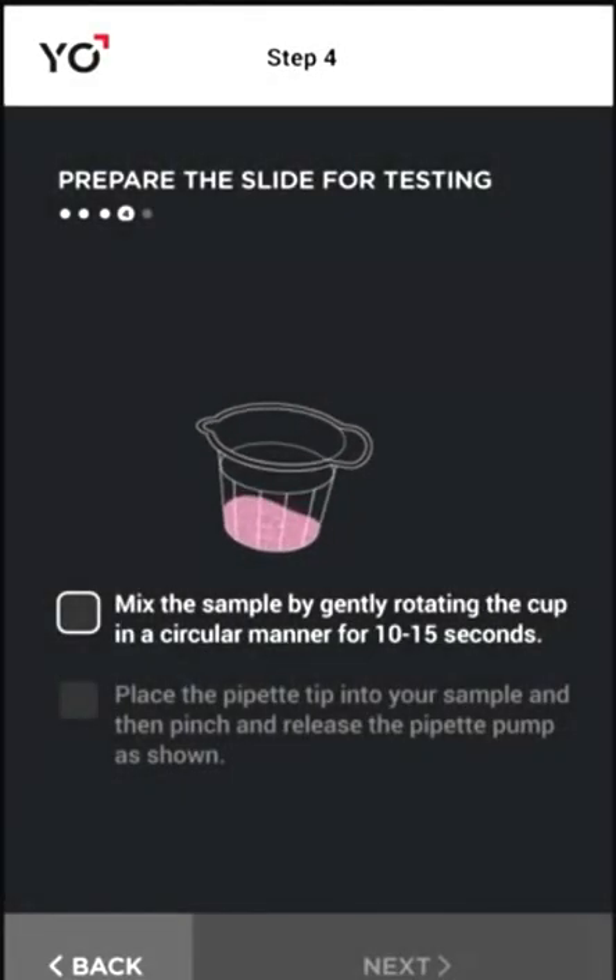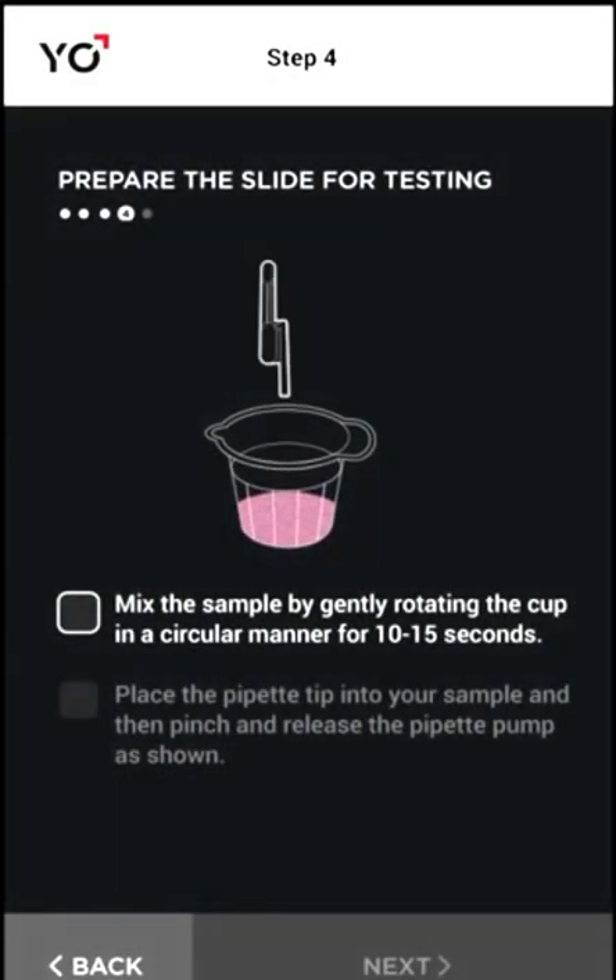Next, mix your sample. Then grab some of it into the little pipette as shown.